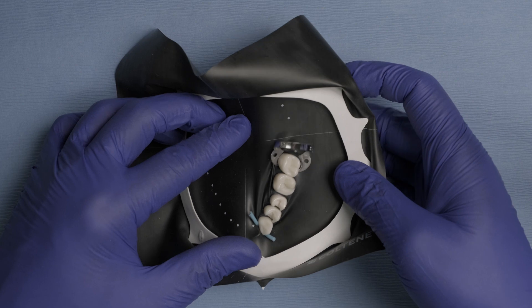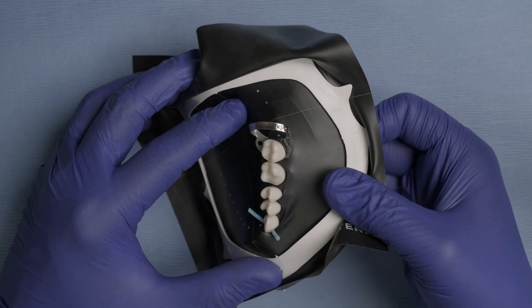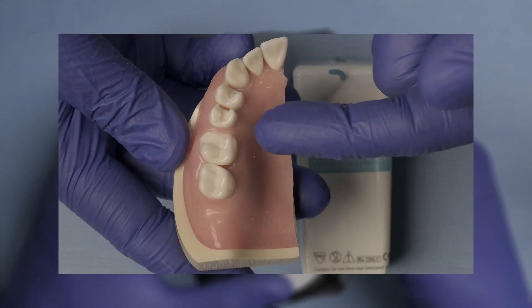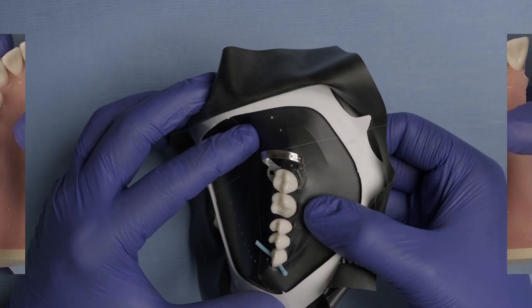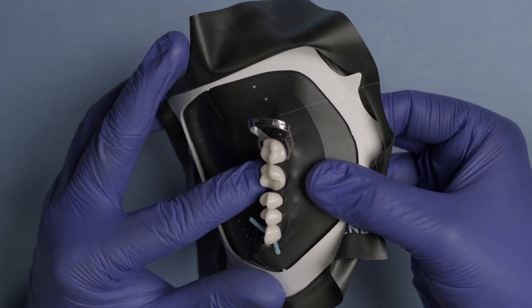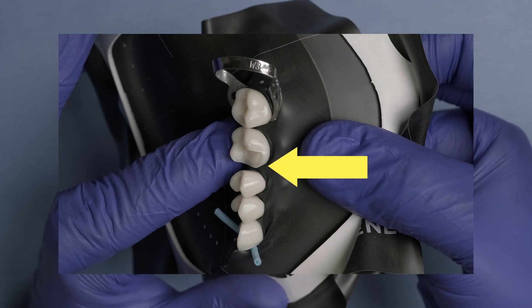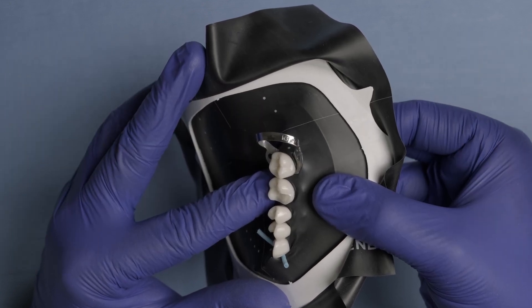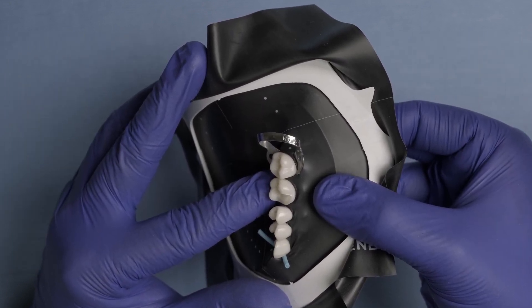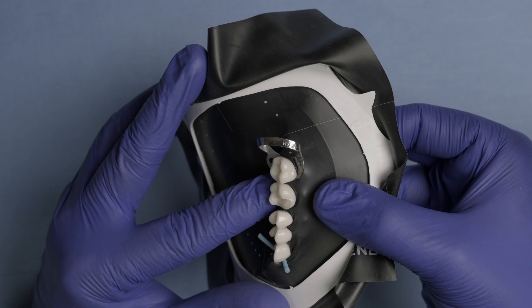I also want to show you the retraction potential of this latex isolate black rubber dam. When I showed you the model initially, the mesial margin of this first molar was completely covered by tissue. Now I don't need any additional clamps because the gingival margin is completely exposed. You have beautiful, clean access to that gingival margin because the rubber dam is inverted correctly, subgingivally, pushing that gingival margin more apical. There is no bleeding, no saliva coming through — this is how you should perform operative dentistry.